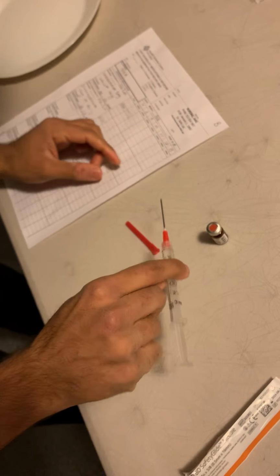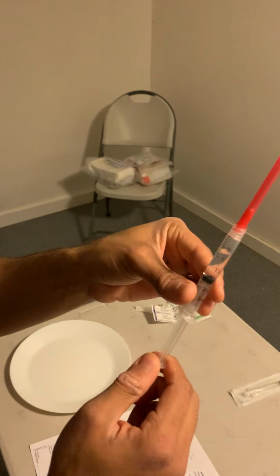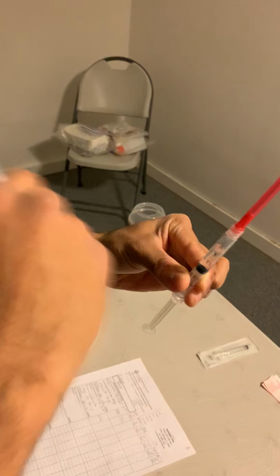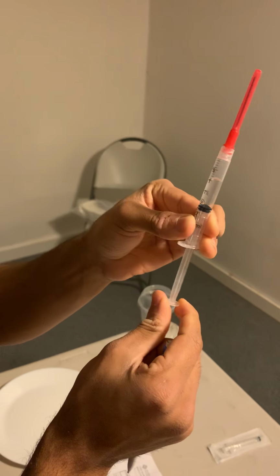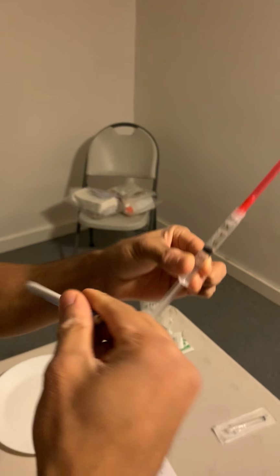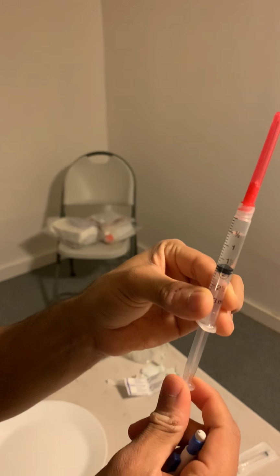So I'm just going to be putting that back down, and scooping this, capping that. I'm just going to be pulling all the medication back into my barrel. I'm going to be using a pen to get rid of any bubbles. I've gotten rid of all the bubbles. All my medication is within my barrel.